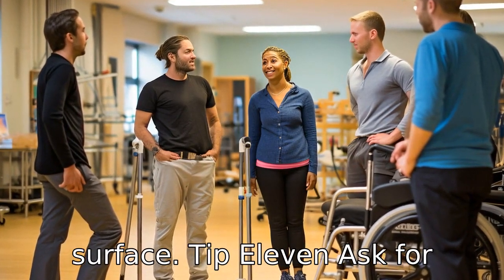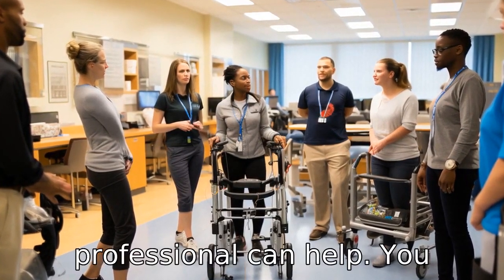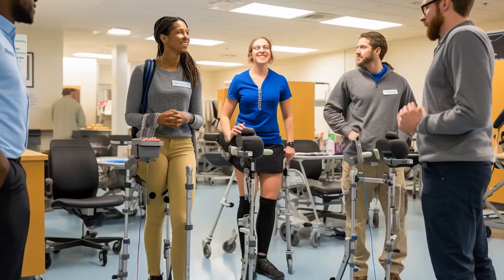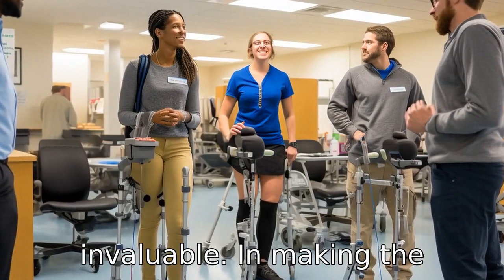Tip 11. Ask for professional advice. A physical therapist or similar professional can help you choose the right walker and adjust it to the right height for the user. Their knowledge and experience can be invaluable in making the correct decision.